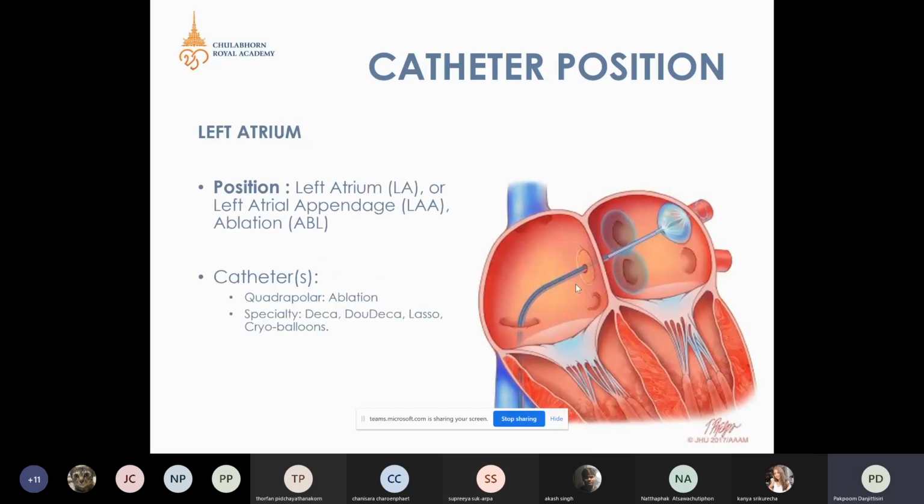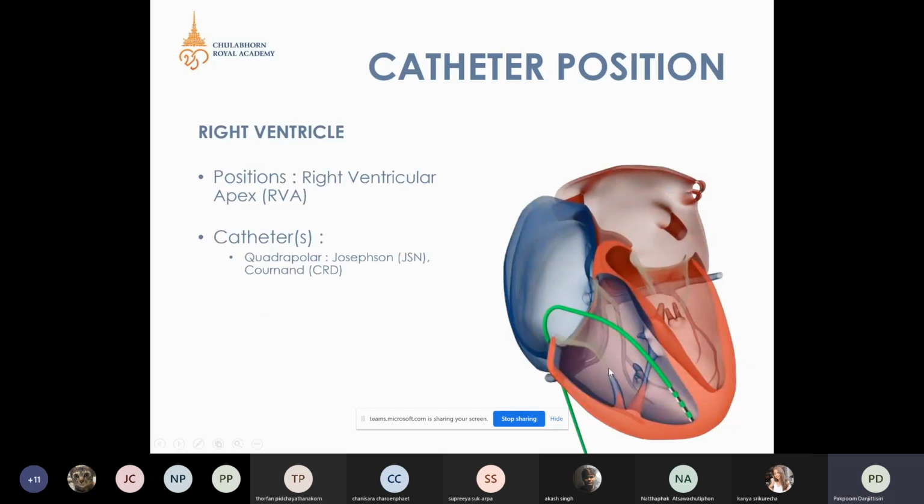of the ventricular contraction. Definitely, if the doctor wants to stabilize the catheter within the right ventricle, because it pumps out the blood all the time from apex to basal, right?